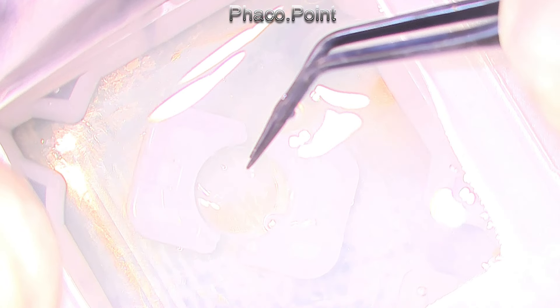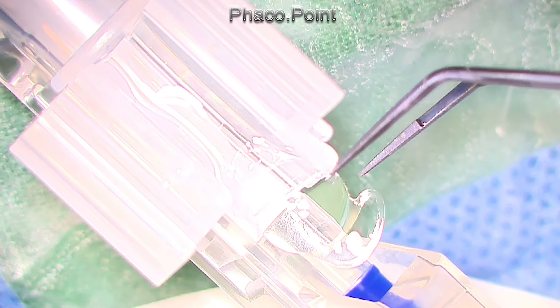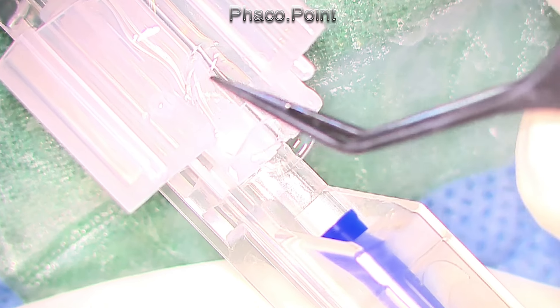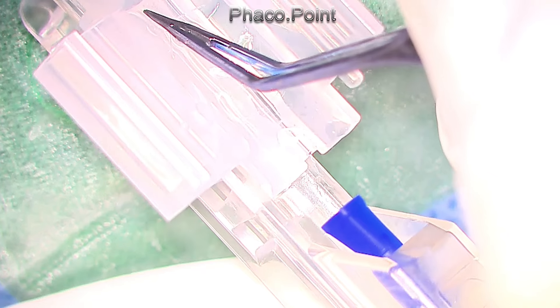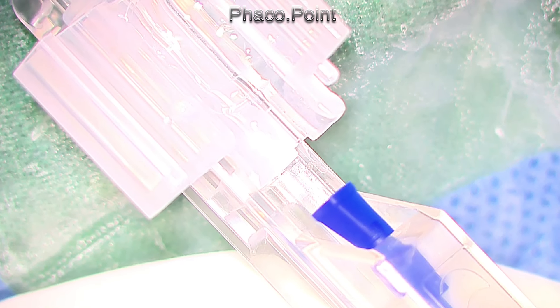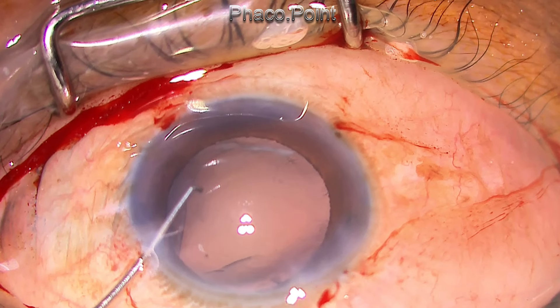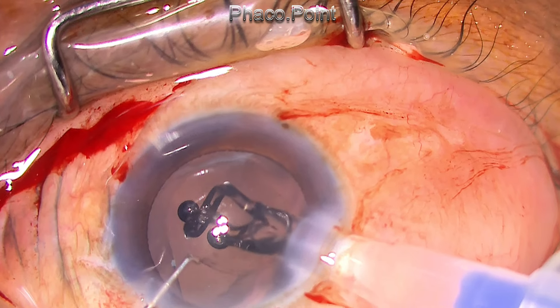This is the Lucidus EDOF lens being implanted in the patient. This is the loading procedure for the same. I certainly do not have any financial interest in the product. I do not have great experience with the Lucidus IOL — I have just implanted a few of them — but they seem to be doing very well with respect to distance and intermediate range of vision. The logic for putting in a Lucidus lens in this patient is that the other eye is extremely clear, and good symmetry and match in visual quality between the two eyes will be achieved with the implantation of an EDOF lens. The lens is injected carefully inside the capsular bag, and with gentle prodding I am able to get even the trailing haptic loop into the capsular bag.